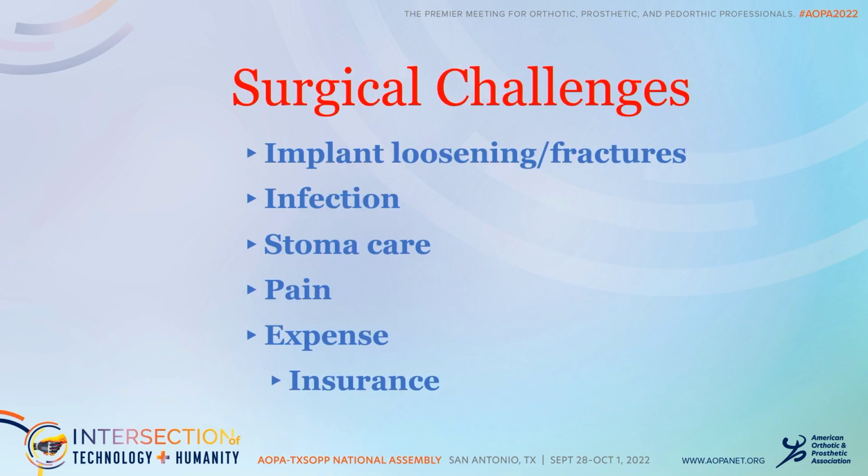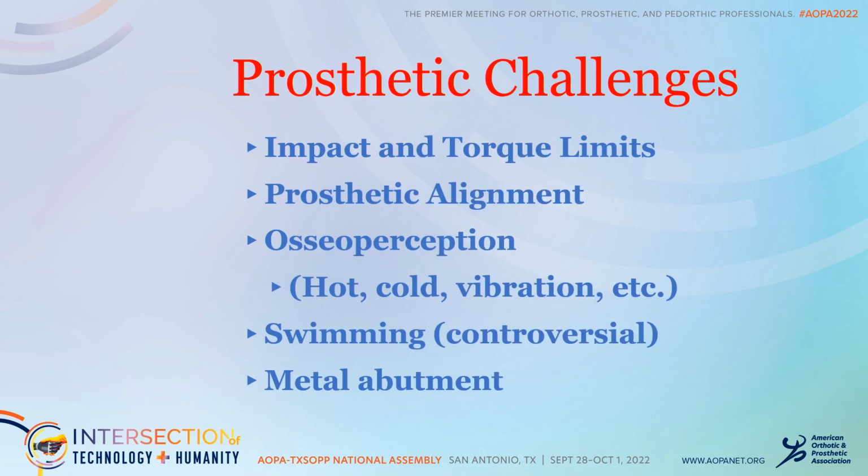There's also some surgical risk, though. This is a big deal surgery, and Dr. Stoneback is going to go through the risks, but they're the things that go along with a large, big surgery, but also things like this, the implant can loosen, there can be an infection. You have a piece of metal going through your skin, so you have to learn how to do the care of that stoma there. There's pain when you have surgery. There's also an expense with that, and then Dr. Stoneback is going to talk specifically about those things.